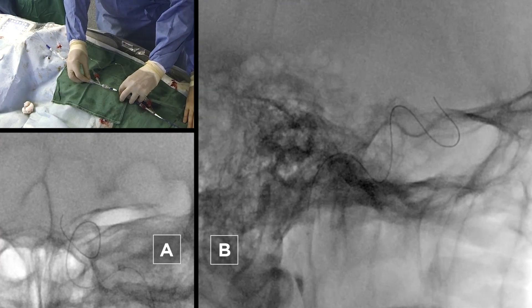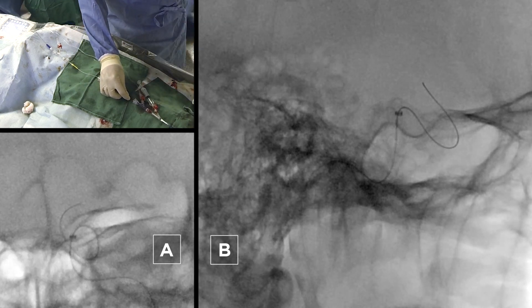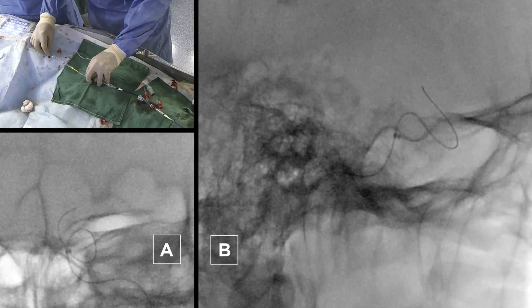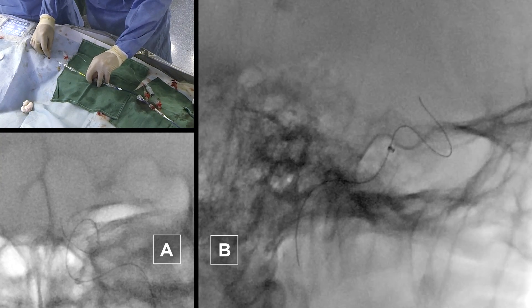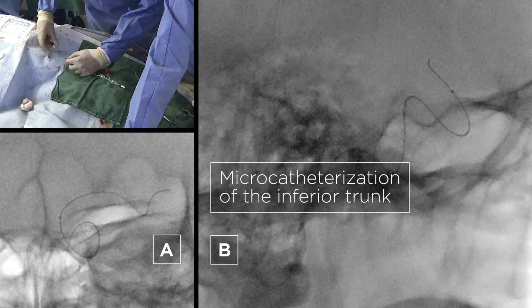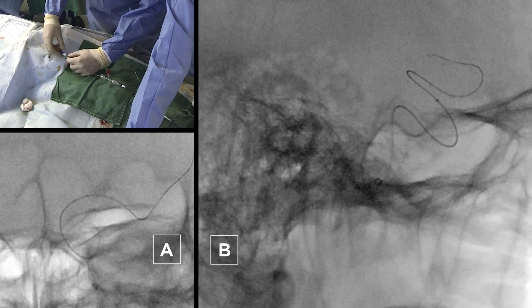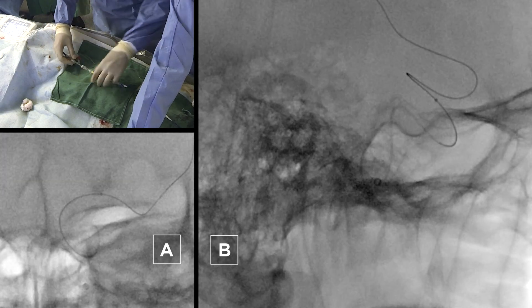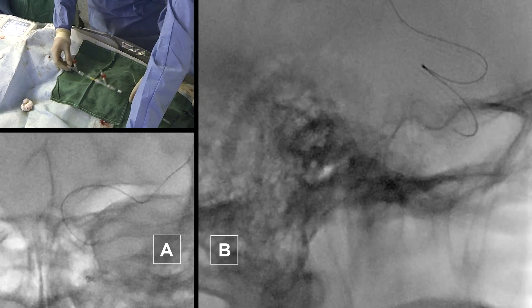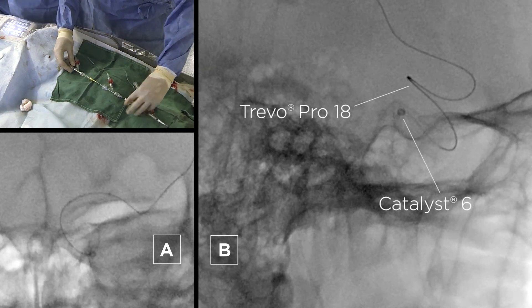We navigate with our wire to the MCA, and as in the SAVE technique, you can park your aspiration catheter in the cavernous segment of the ICA — you don't have to go all the way to the carotid T. You first go with your micro catheter distal of the clot into the M1, with the target of placing the micro catheter in the inferior trunk of the MCA. We have published this before, and others have also shown that navigating towards the inferior trunk gives better results. That's the typical positioning in the inferior trunk. We then push the micro catheter towards the M2 segment.